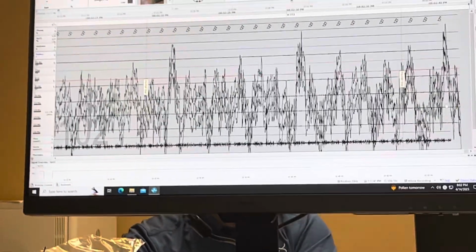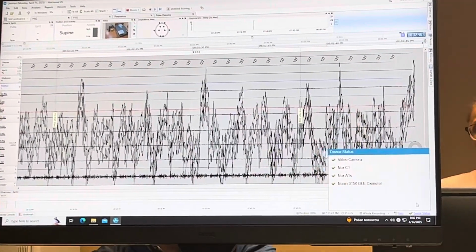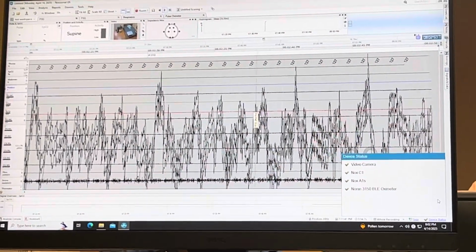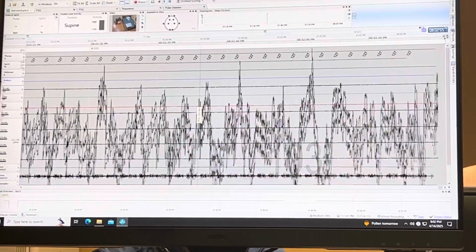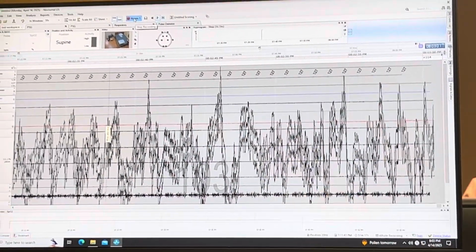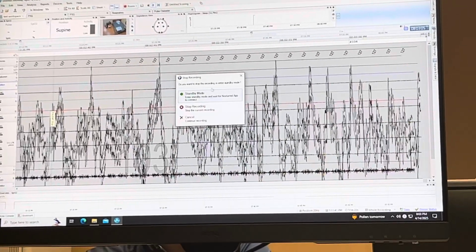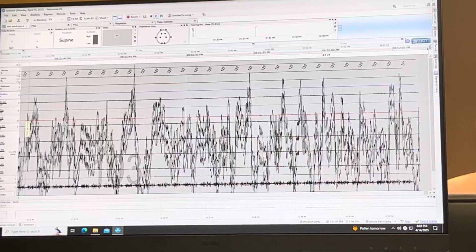And now, if you remember, we did not connect to the TX link. So we need to add the TX link into our recording in order to be able to control the PAP. So we've pre-PAP stopped. What we're gonna do is we're gonna briefly stop the recording, which is this red button up at the top over here. We're gonna hit stop recording. It's gonna say, are you sure? You're gonna say yes, stop recording. You're gonna give it a second.